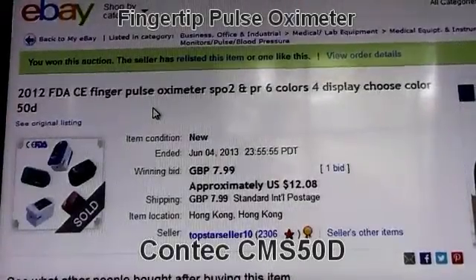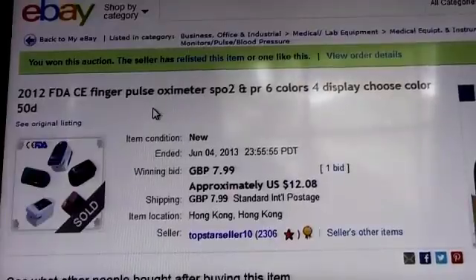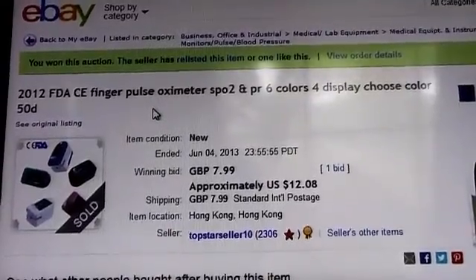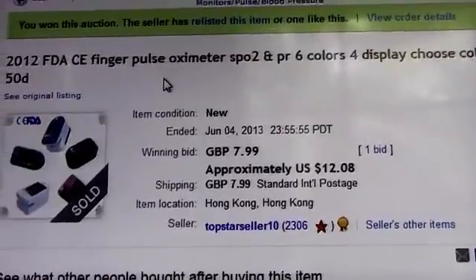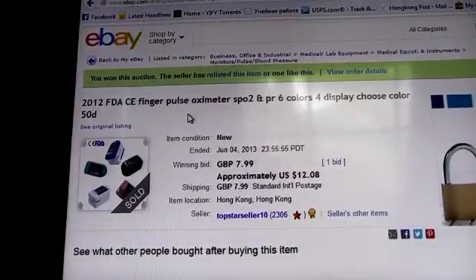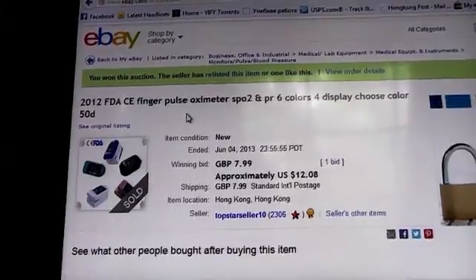Hey guys, today I'll be doing an unboxing video about a pulse oximeter that I've won on auction from Hong Kong, China, from this seller, Top Star. This is a Contec CMS50D that I purchased a month earlier, so here's an unboxing video.